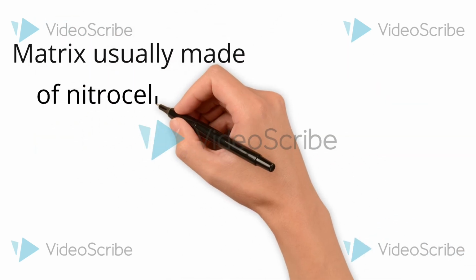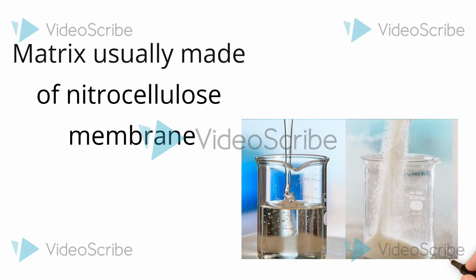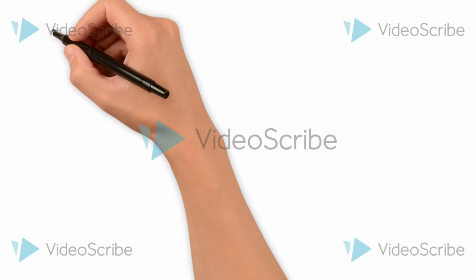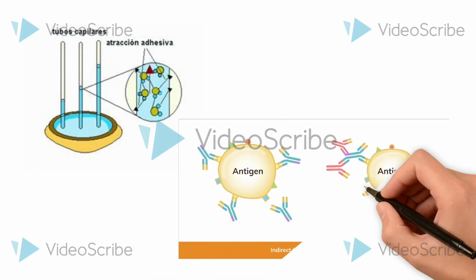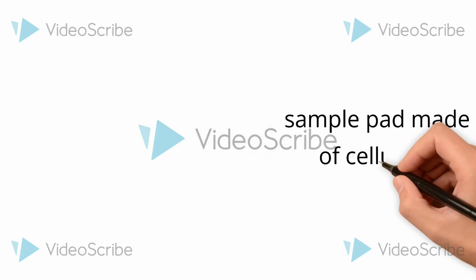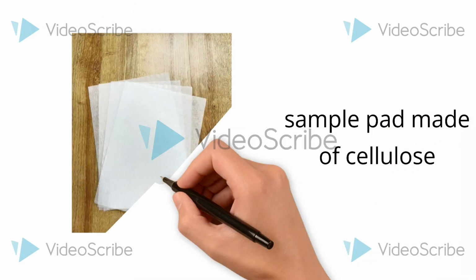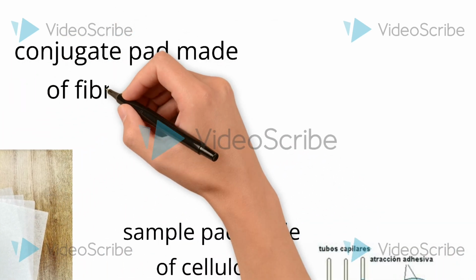The matrix of the immunochromatography strip test is usually made of nitrocellulose membrane, which allows capillary flow and immobilization of antibodies. Other support materials include the sample pad made of cellulose or polyester, the conjugate pad made of fibrous glass or polyester, and the absorbent pad made of cellulose.